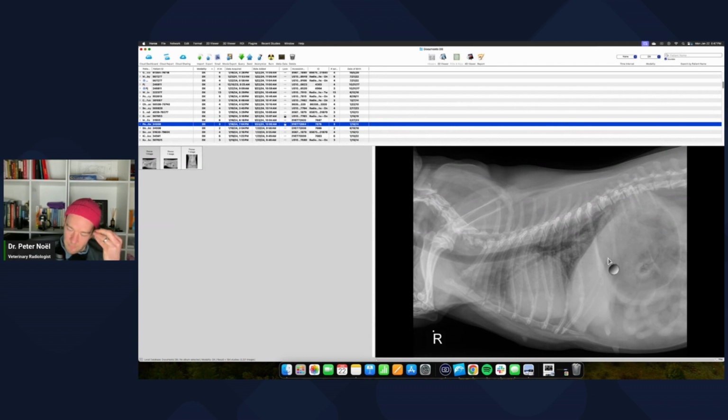And so this, I think, is concentric hypertrophy, which the wall gets thick, and so it kind of grows inside. And those are harder to detect radiographically as opposed to an eccentric hypertrophy. You'd think mitral valve disease. Eccentrically, it's too much volume. The lumen gets big and it just gets really huge, and it's very easy to see. These are more difficult. So yeah, I think right-sided enlargement.